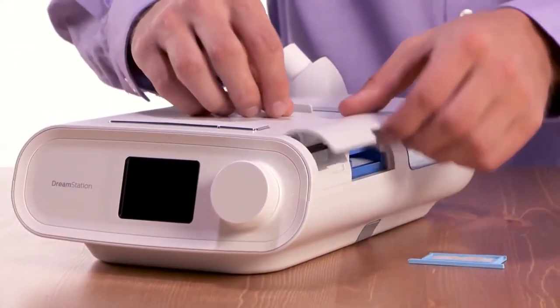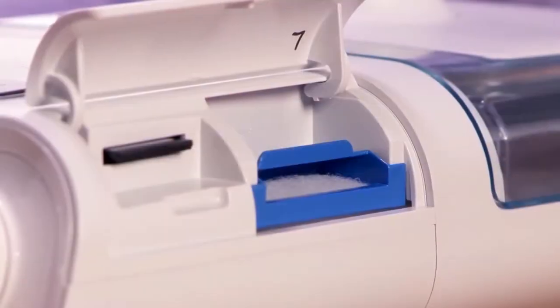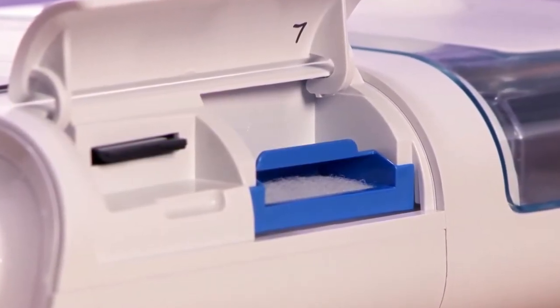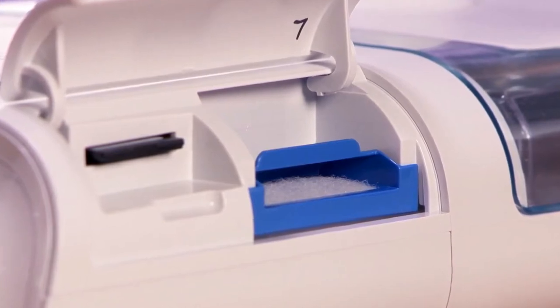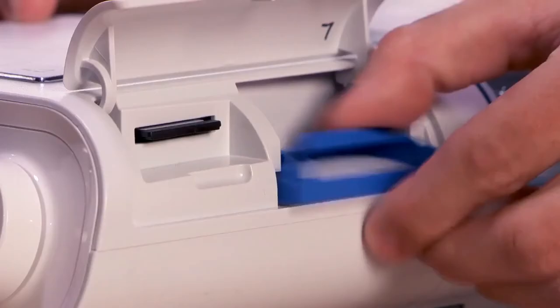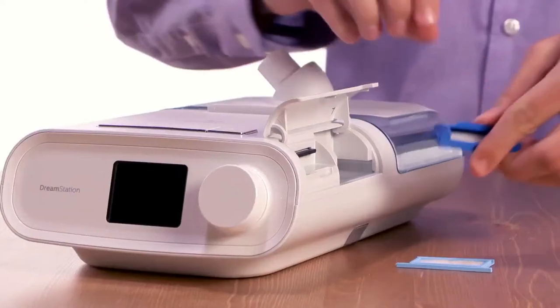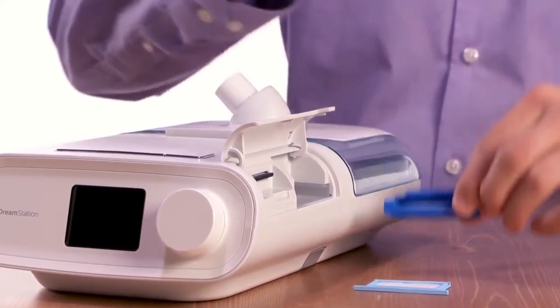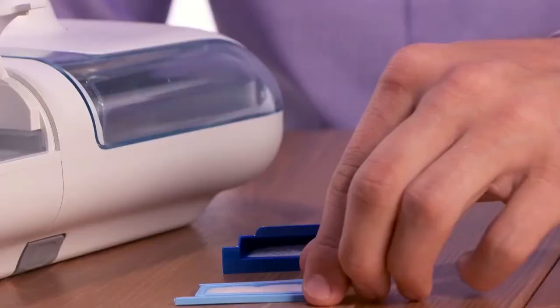Lift up on the filter access door and swing it open. Check to make sure a blue pollen filter is in place to screen out normal household dust and pollens. Remove the filter assembly. In addition to the reusable filter which comes installed in your DreamStation, there is a disposable ultrafine filter.